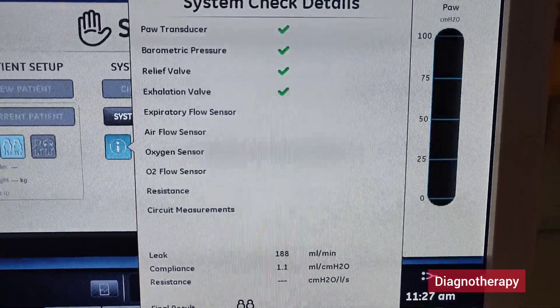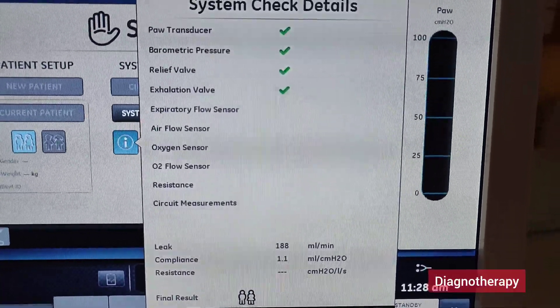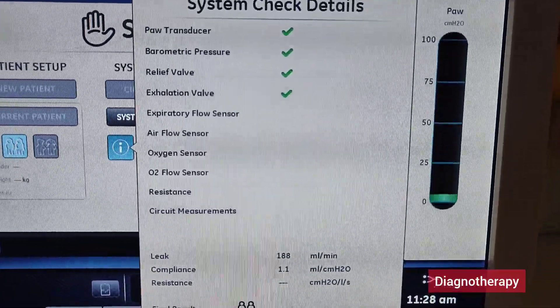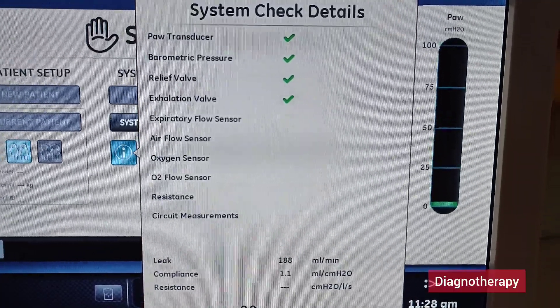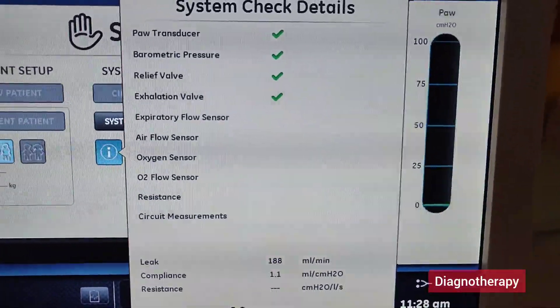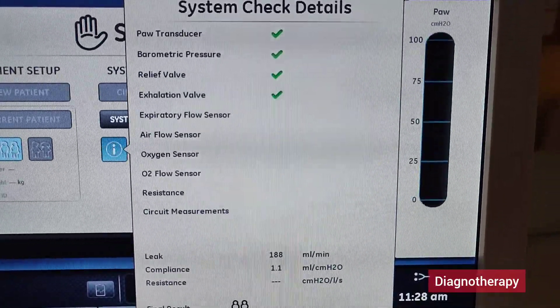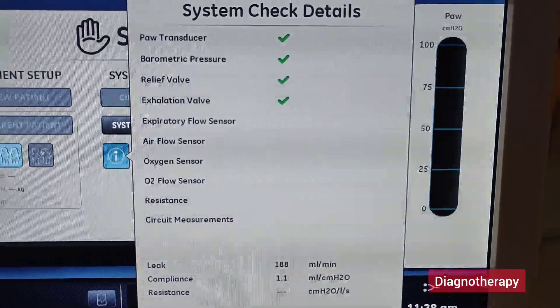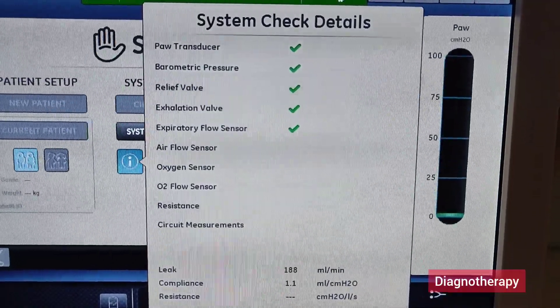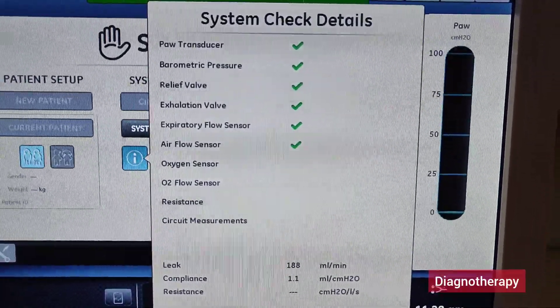Then the exhalation valve is checked. After that the expiratory flow sensor is checked — the expired air coming from the patient is tested at different velocities, first low velocity then higher velocity. Depending on that, the air is taken out by the ventilator and the flow goes to the flow sensor. The flow sensor has a range of values and in that range it checks the flow sensing.